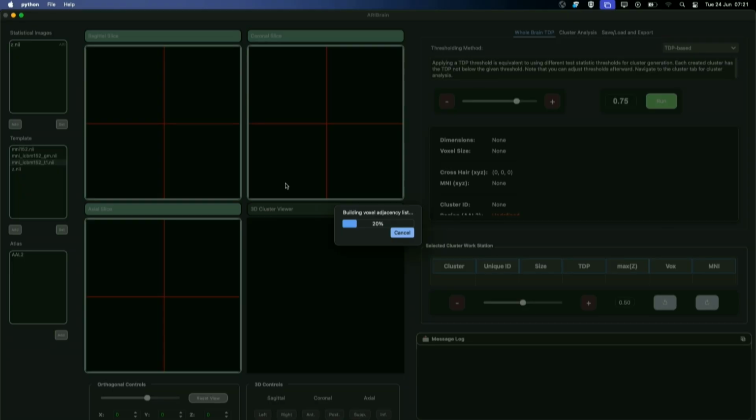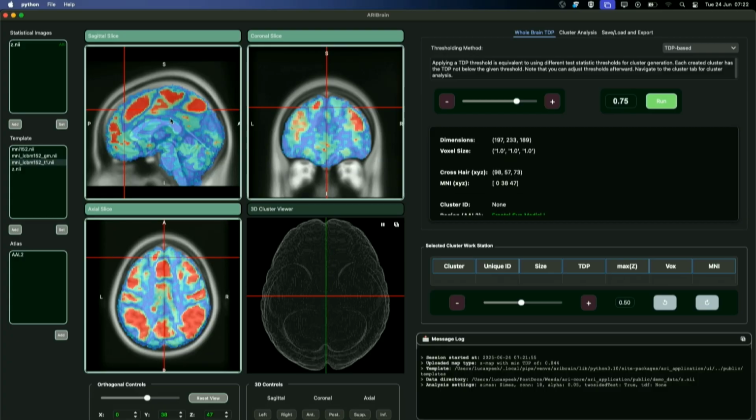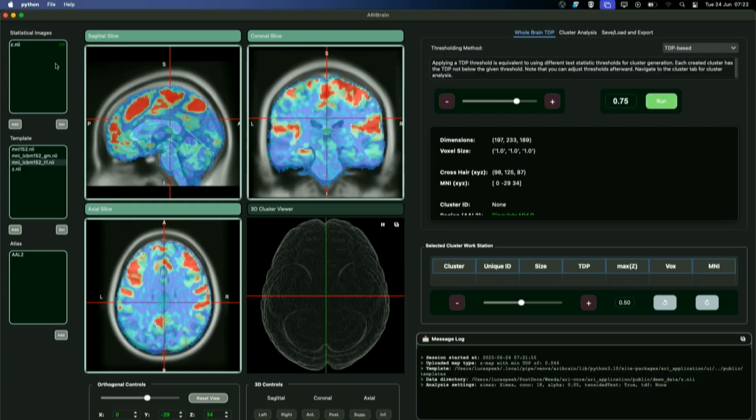So now it's communicating through Cython, which is a bridge between Python and C++, and it's communicating with the C++ backend. It's doing all the computations, and it's sending that information back to the front end. And that's the longest that it takes. And so that's the gradient map that I was speaking of before. So there's a lot going on, and before I start interacting with the data, I just want to explain a little bit how it's set up.